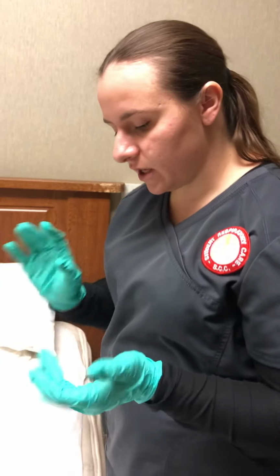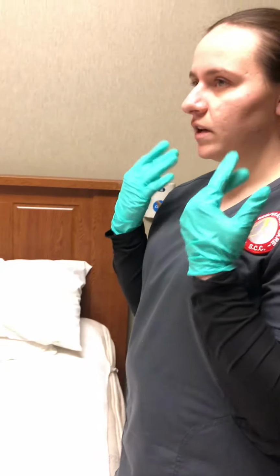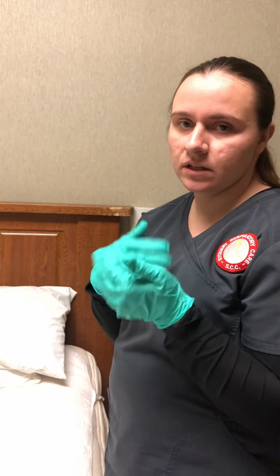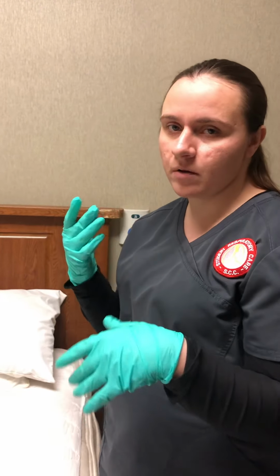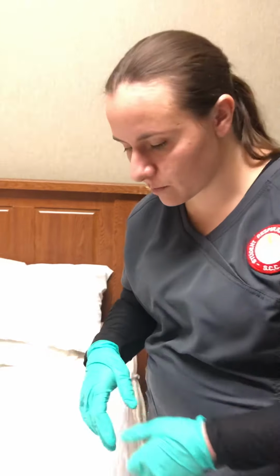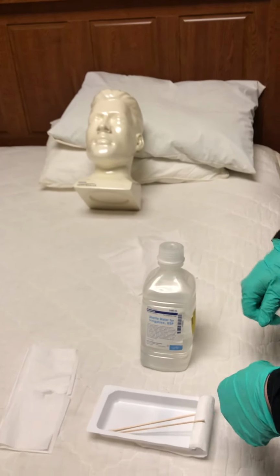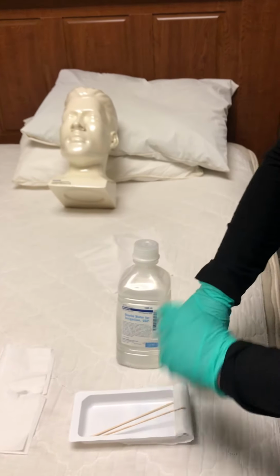And then once I'm ready, I have my PPE, so I could do a face mask or anything like that, just in case there's any splashing, anything that could come up and splash on me. That way I protect myself from any secretions or anything like that. So I'd open up my trach care kit. Since I don't have one, I'm just using this as my trach care kit.